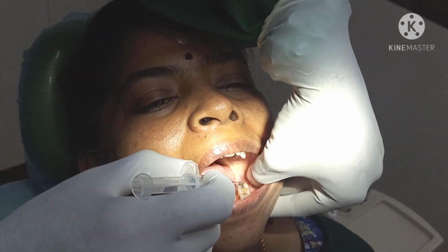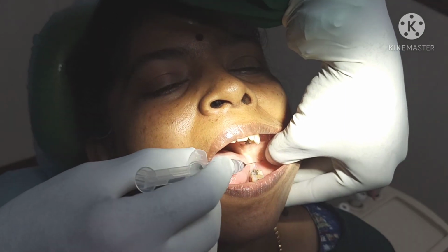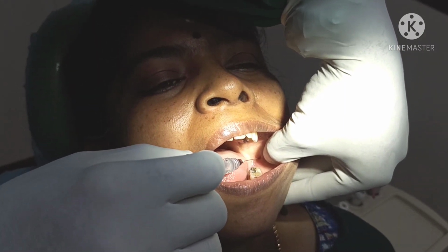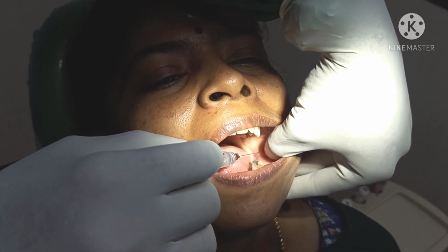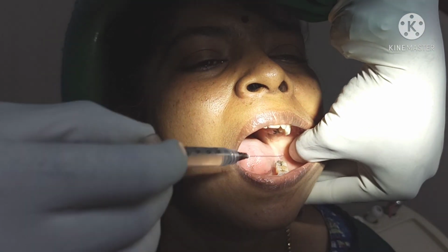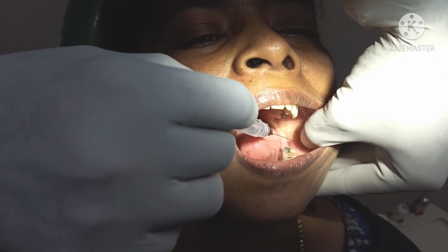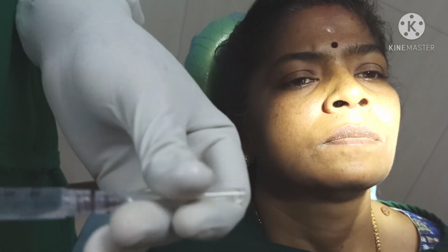Only one small improvement in the technique: if you are planning for 8 removal, instead of giving one infiltration here, I am going to give infiltration here. So this is the long buccal nerve block, distal and buccal to the last standing tooth, 8 or 7. If you are planning for 8 removal, give multiple infiltrations, 3 or 4 sites. Along with anesthesia, you will have bleeding control also when you elevate the flap to remove the impacted 8.